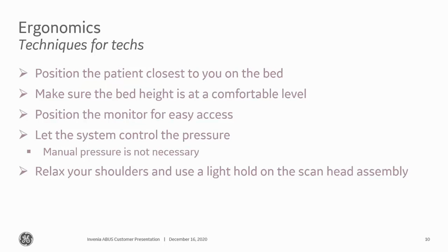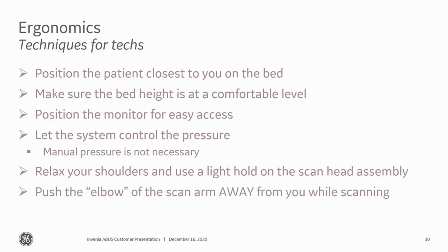Remember to relax your shoulders and use a light hold on the scan head. If any of you have trained with me, I try to remind you of that over and over and over. Just relax your shoulders, and you can tell a big difference when you loosen your grip on the scan head too. So just remember, you have to maintain a light hold on the scan head and keep your shoulders relaxed. You have to tell yourself that a few times though to make it stick.